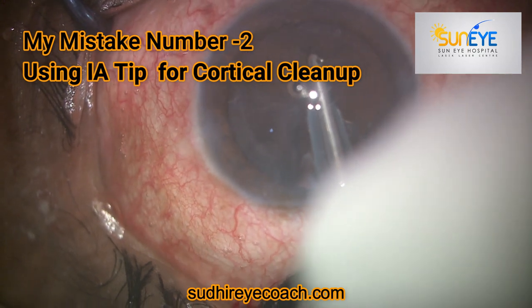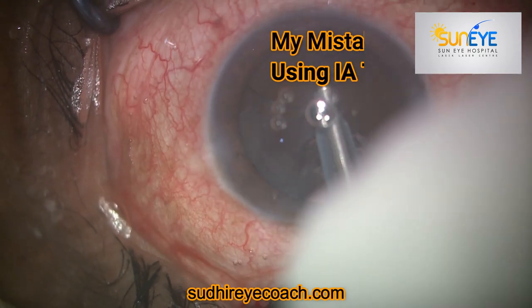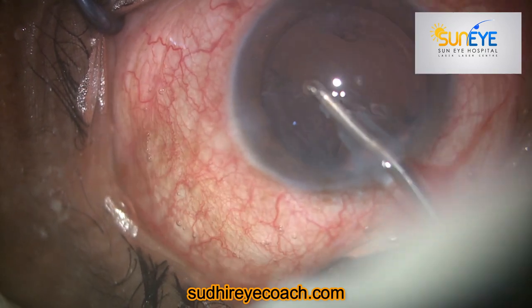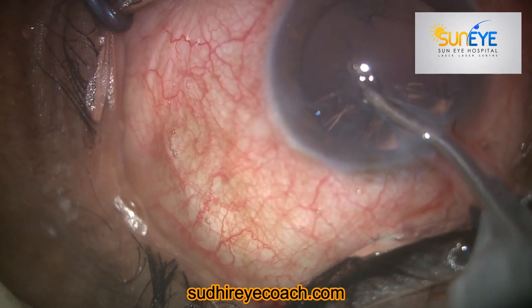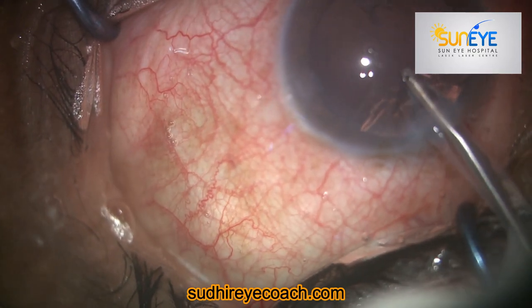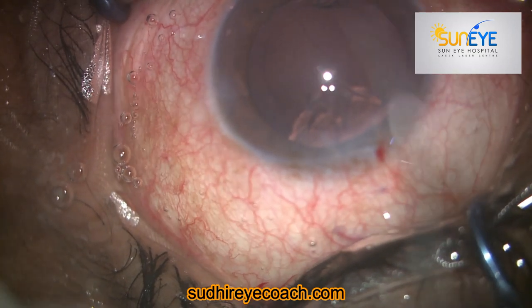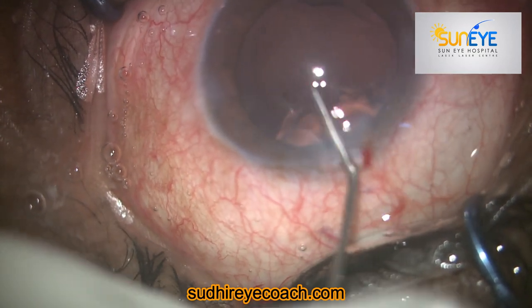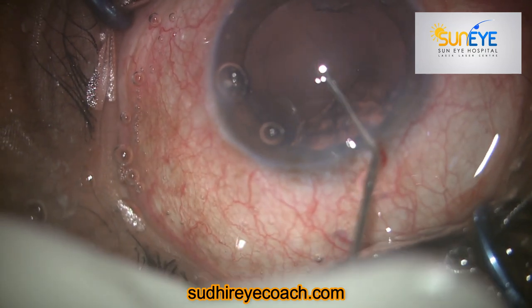This was my second mistake — because I entered with the I&A tip and started aspirating. That much aspiration and fluid in the chamber will definitely create extension of the posterior capsular tear and dislodgement of vitreous. Ideally you should prefer dry aspiration using a simple cannula, because that will create less turbulence in the chamber and you can easily aspirate the cortical matter.